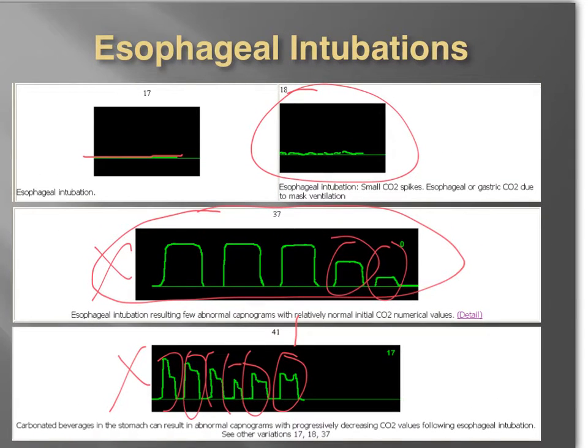It's very possible that you could have this type of waveform where it's in the esophagus and you have a lot of carbon dioxide buildup in the stomach. It's always possible to somehow forcefully move carbon dioxide into the stomach when we're overzealous with our bag valve mask ventilation. Maybe there's some recirculated carbon dioxide in the dead space that gets moved to the esophagus. Though I don't think we would have huge readings like this. We'd probably have readings more like this again. Okay?